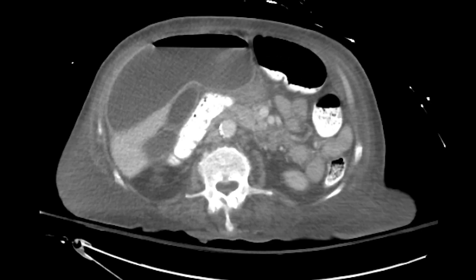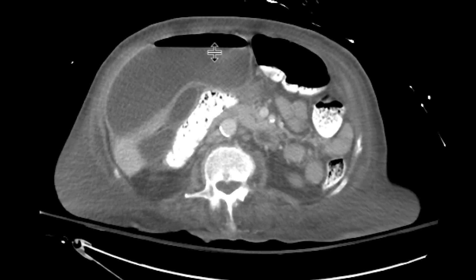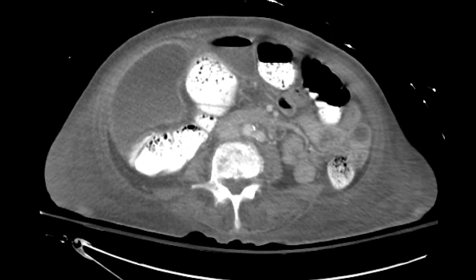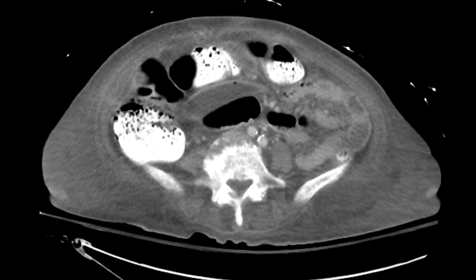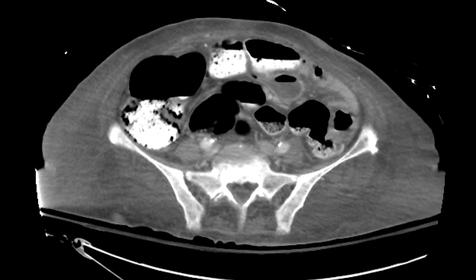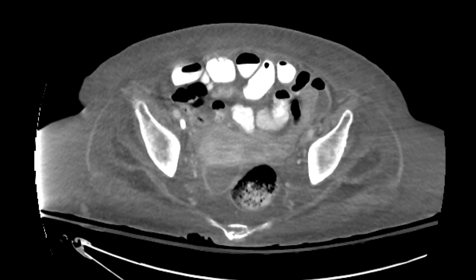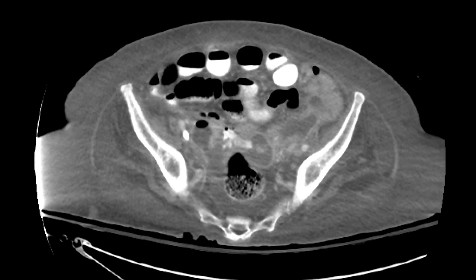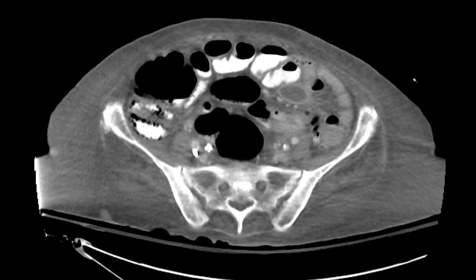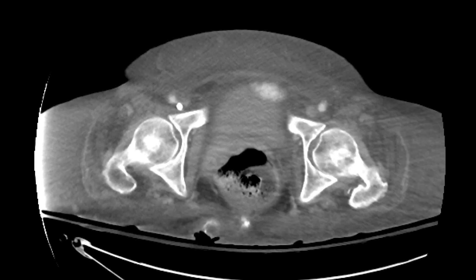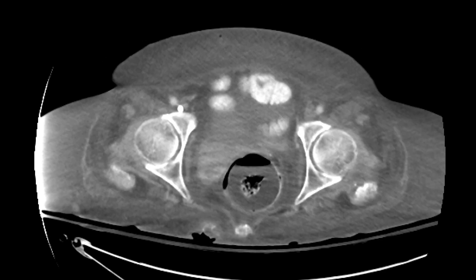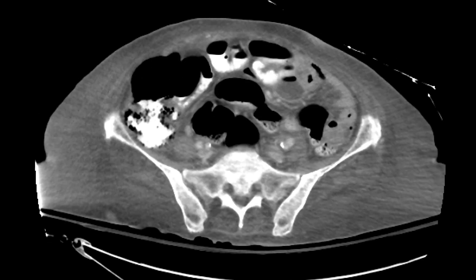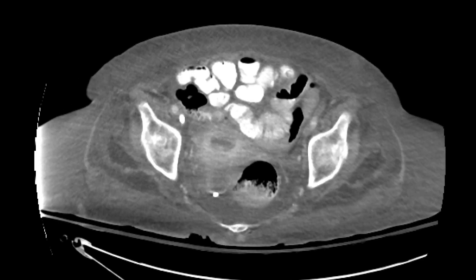As you scroll, you see this large subhepatic collection with an air-fluid level and rim enhancement — a large abscess. Continuing on into the mesentery, scrolling further, you can see additional abscesses in the pelvis: one large one here, communicating with another abscess within the mesentery in the left lower quadrant.